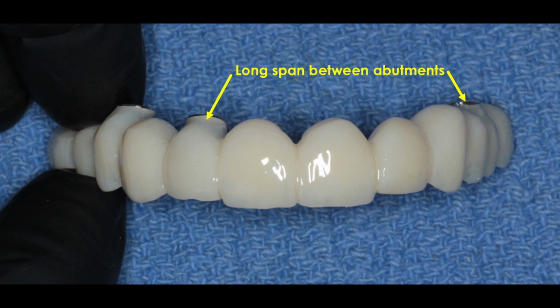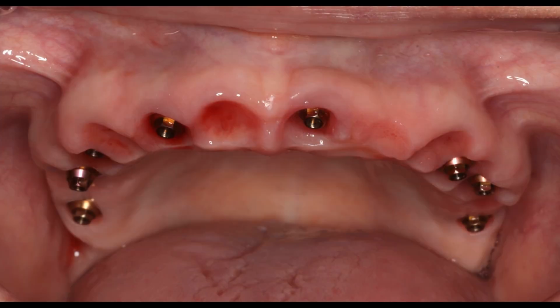In spite of the number 10 implant failure and the placement of the number 9 implant, look at how nice the tissues have recovered. It's pretty remarkable what can be done as long as you're not taking away a lot of bone at any of these surgeries.